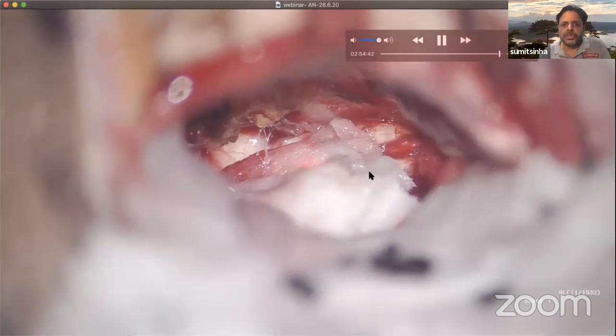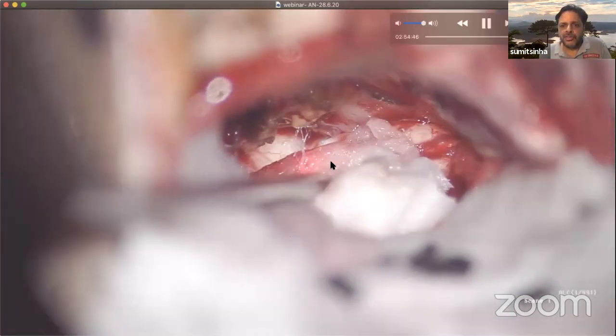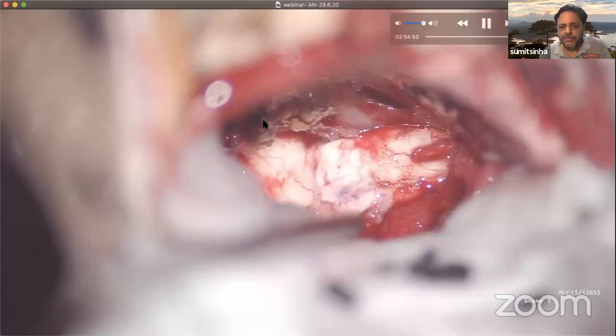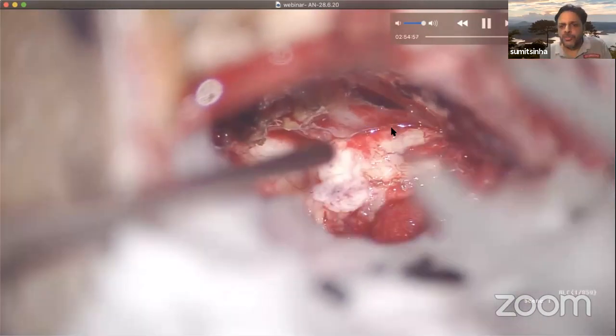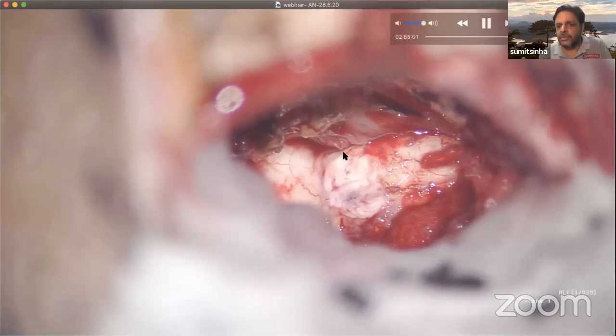So this is the complete removal as much as possible. Some part of the tumor tissue attached to the porus lip is being left in order to save the facial nerve. And here you see, beautiful, the brain stem over here. This is the facial nerve, which is stimulable functionally. And this completes the end of the surgery.